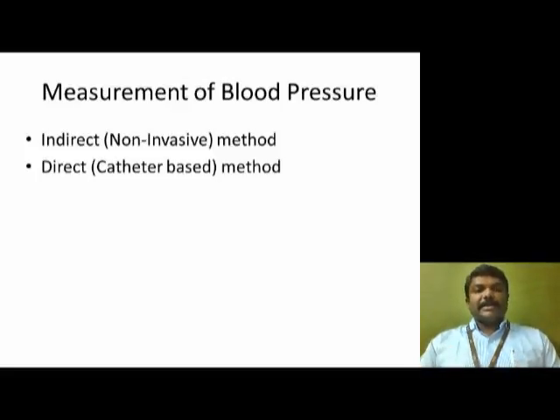So that's the indirect method. But on the other side, the indirect method is not always that accurate. It will be an approximated value. But in the case of a direct method, we get an exact reading.